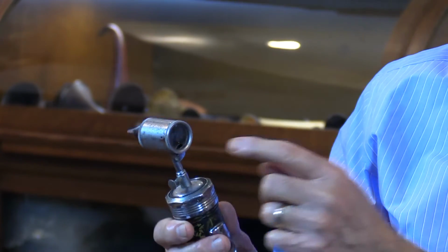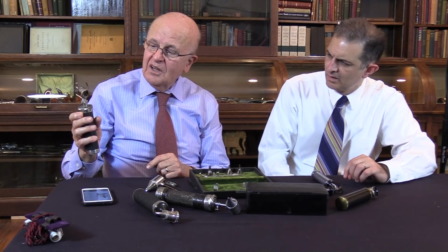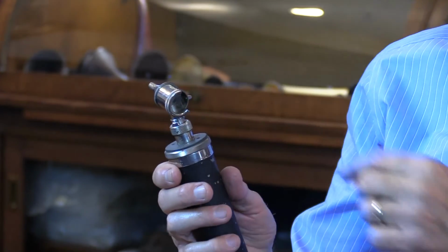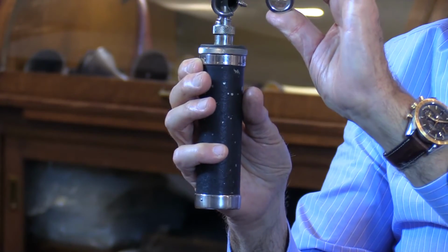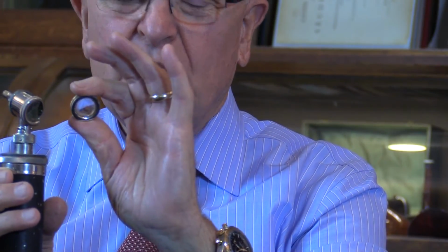But anyway, then some of them had a larger opening. So they can magnify the eardrum and introduce the instrument. And these here, you can take this out and use this, as you can see, by comparison, to use only magnification.